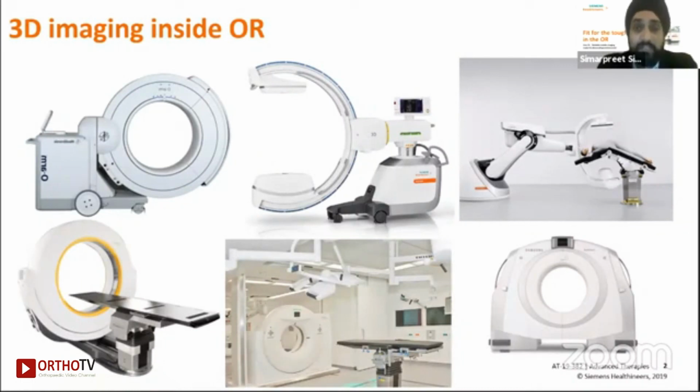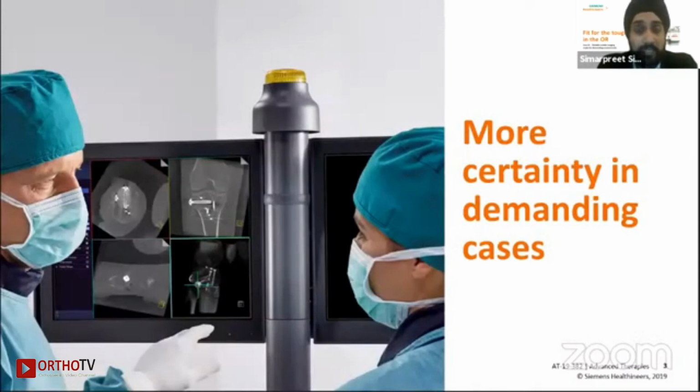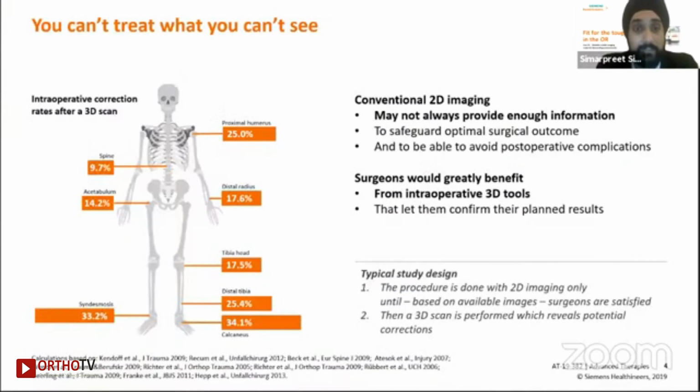But first and foremost, why do we need 3D imaging? The answer is definitely to get more certainty in demanding cases. I second the thought that Dr. Tanna presented, that it is always better to have two C-arms, not just as a backup, but also to have two views of the same anatomy, one in the anterior posterior view and the other in the lateral view. A 3D C-arm or a 3D imaging device can give you those two views with only one shot. So practically speaking, it is less dose for the doctor himself.